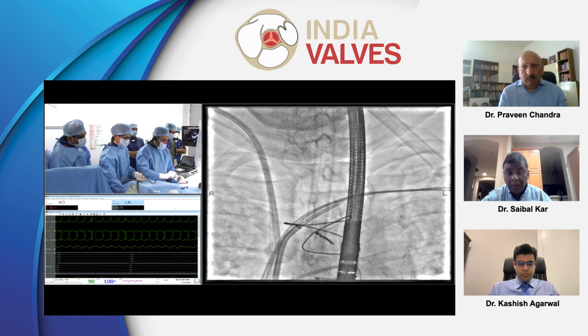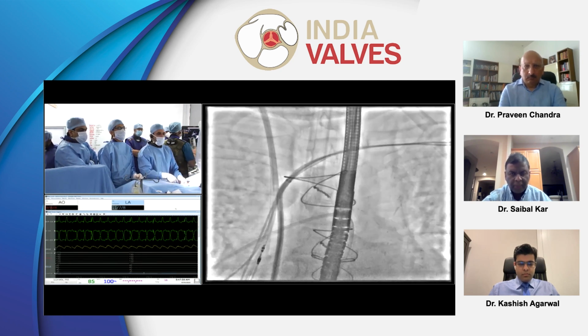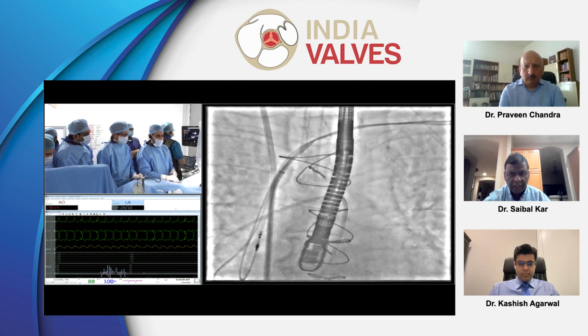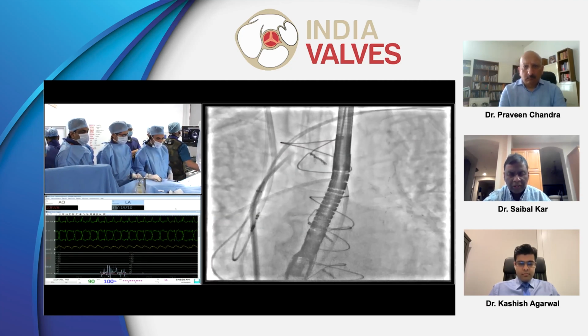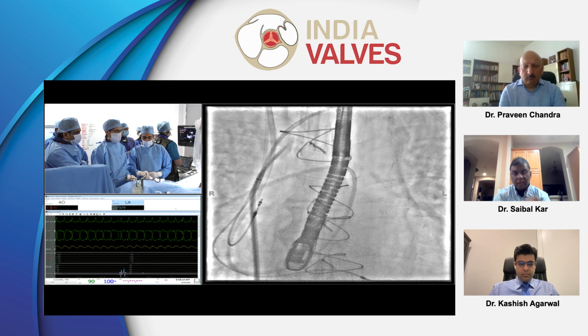Also, the repair rate of a patient with flail A2 is not that easy when you have low EF, because this is like a mixed pathology. So this is a great case. Now, from the MitraClip standpoint, it's also a great case because it's a localized area of pathology. You see a localized A2 flail, and the rest of the leaflets are normal. The posterior leaflet is slightly restricted, and these candidates do very well with edge-to-edge repair.